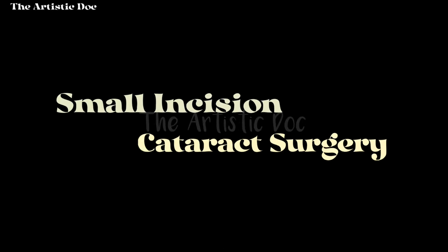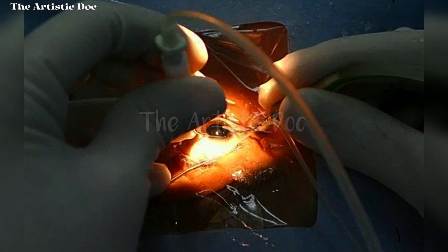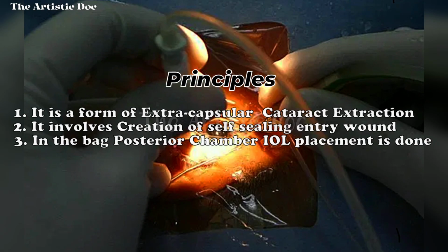Small incision cataract surgery. First, see the principles of cataract surgery. 1. It is a form of extracapsular cataract surgery. 2. It involves creation of a self-sealing entry wound. 3. Here, in the bag, posterior chamber IOL placement is done.